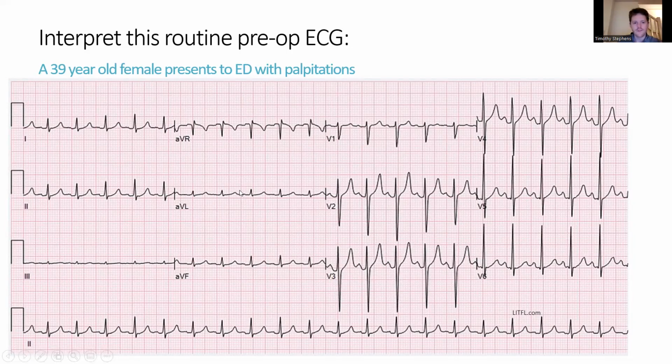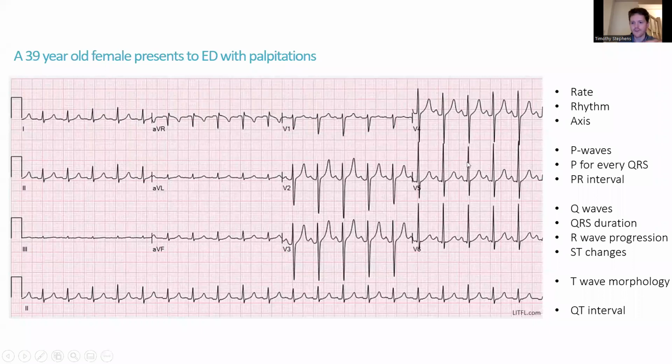So I've created some reference things there. So just to go over that quickly. So you should see here on the right, basically a quick summary of that. So yes, you're going to include all your patient detail. It's very important. Fortunately, I can't include that on here, but that is absolutely bang on. You're absolutely right. You should do that.